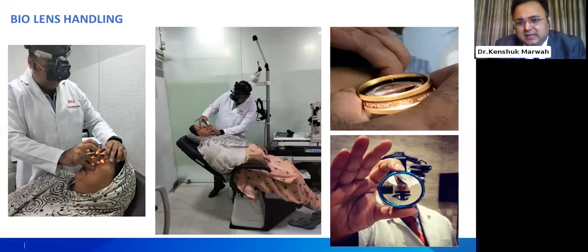And how to hold the lens? On the lens there's a silver marking, and that silver marking on the lens edge should be towards the patient. That helps give a better image. And the other thing is, if you cannot make out the silver lining, the letters which are mentioned, like in the above lens, aspheric, should be straight.